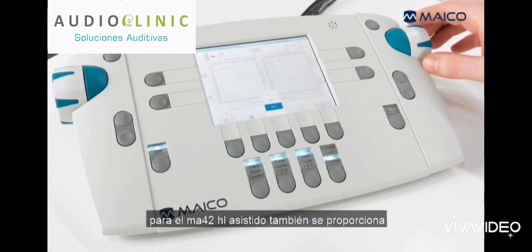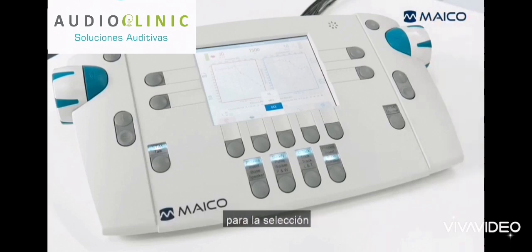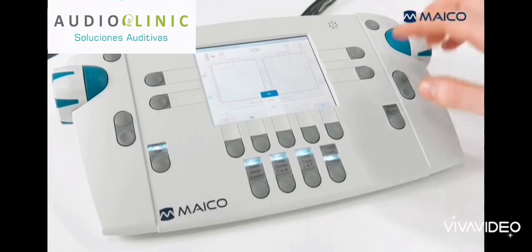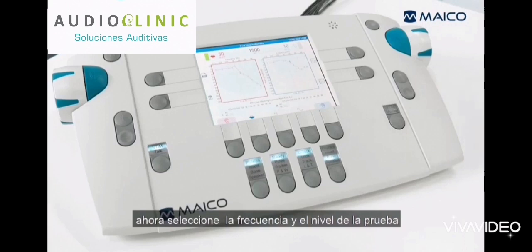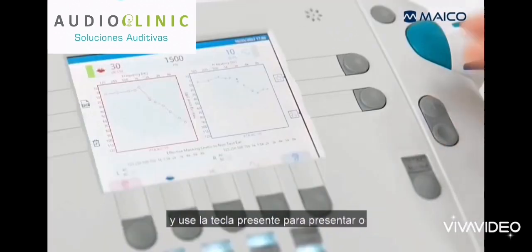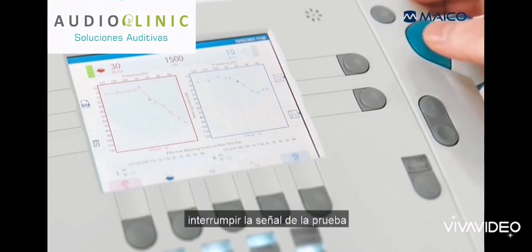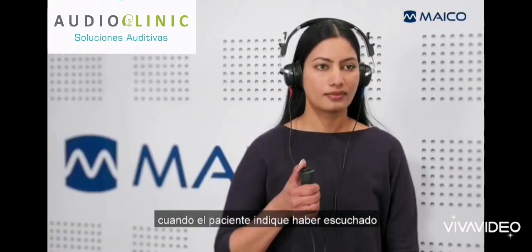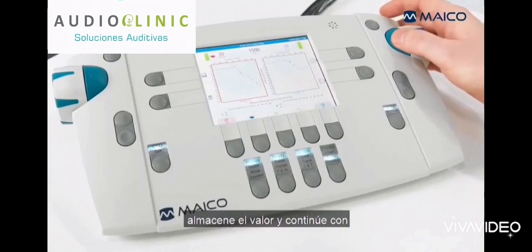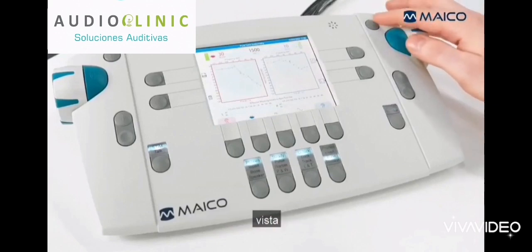If a speaker configuration is calibrated to the MA42, HL aided is also provided for selection. Now select the test frequency and level, and use the present key to present or interrupt the test signal. When the patient indicates having heard the signal, store the value and continue with another frequency or change the ear side.